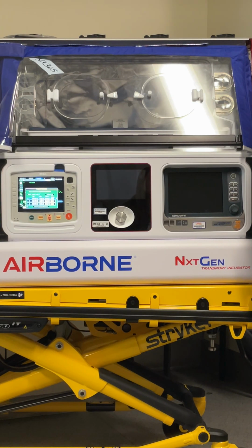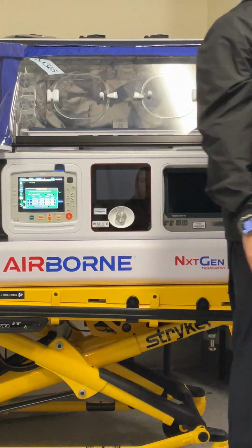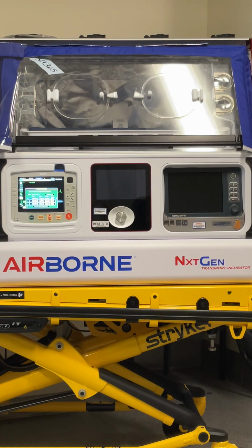What's the button below what looks like a monitor? The colored clipboard. It has a green arrow and then it looks like it can hook up to something. This is USB. So if you were going to take the data out using a USB drive, you could stick it in there, which you would never be able to do because of where the USB is located on this device. It's right here. So you would have to be a contortionist and have a really weird thumb drive to be able to do it. You'd probably have to have a 90-degree USB cable, because you wouldn't be able to get a straight stick in there.